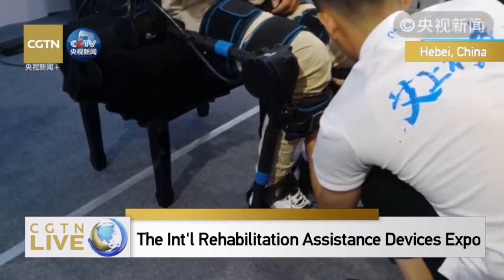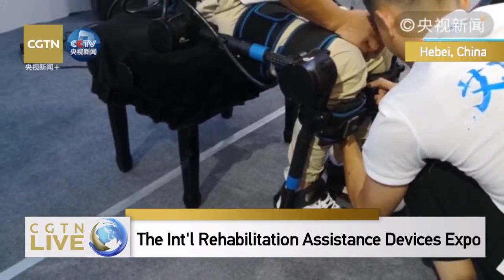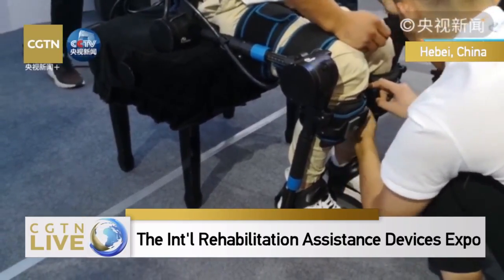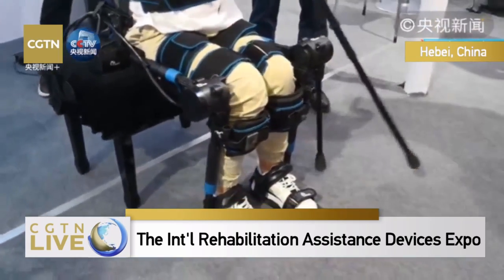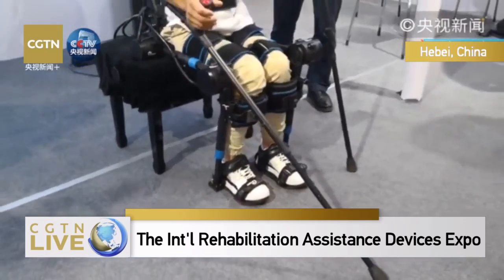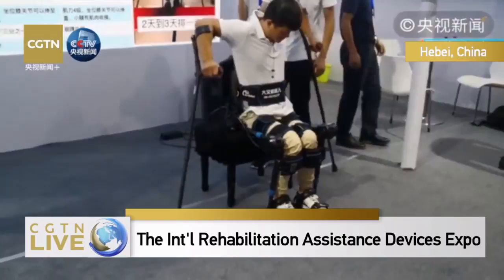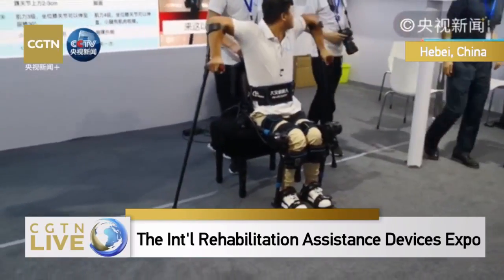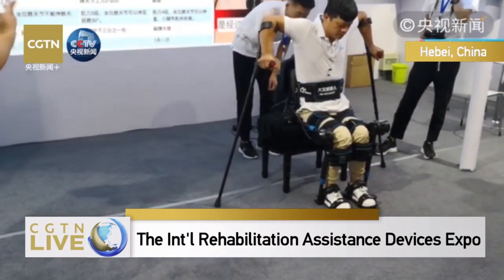This is a patient with some spinal cord injuries, and this device can help him to do some restoration and rehabilitation. So a large number of patients can restore full or part of the motor function.